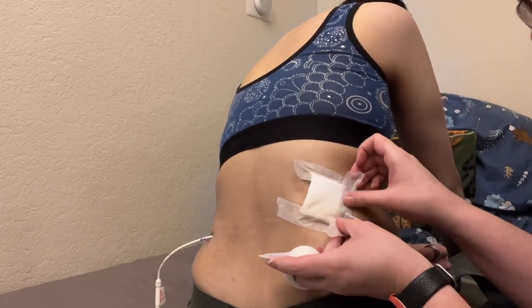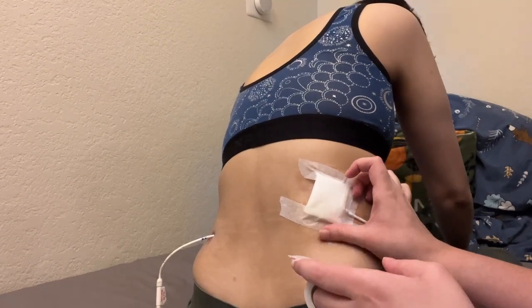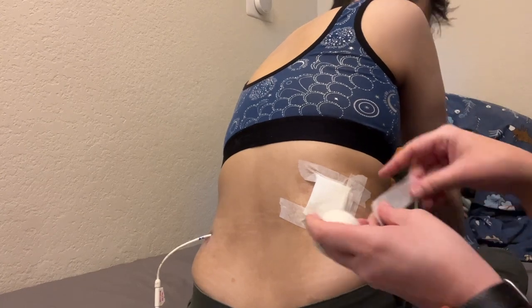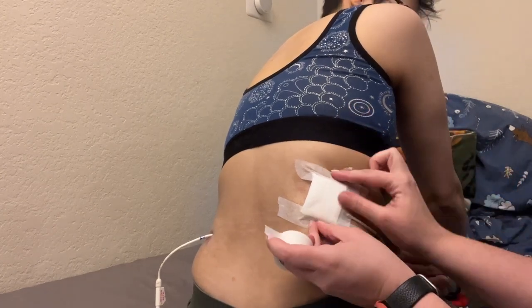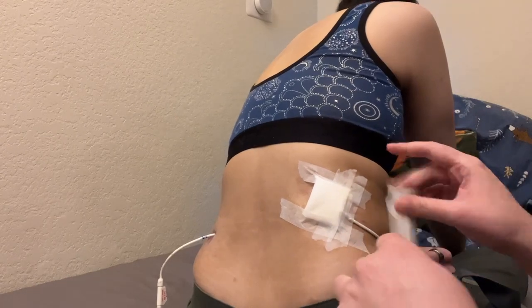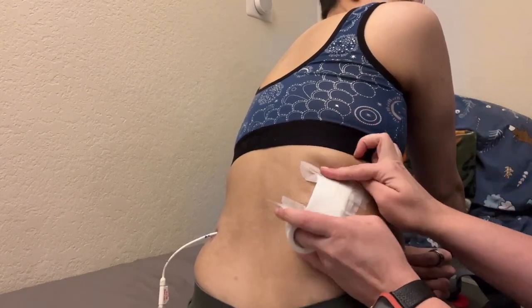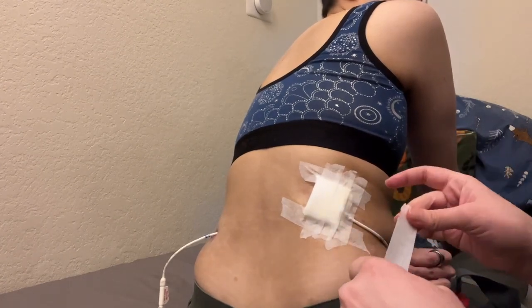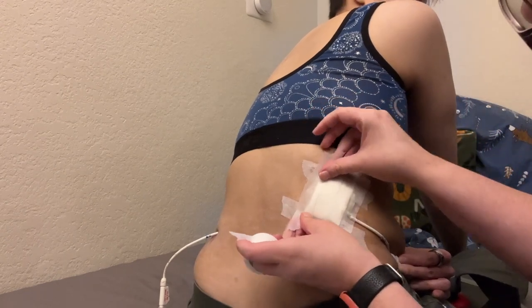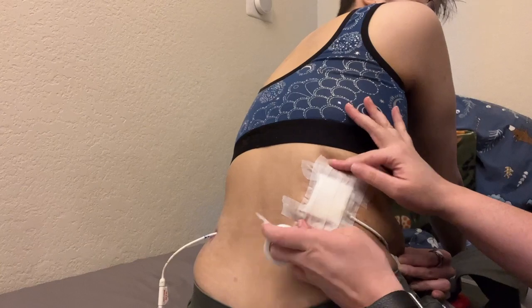Now I'm using a paper tape to completely cover the gauze, and the adhesive of the tape is sticking to where I put the Sure Prep. This paper tape — we got it at Target, it's Johnson & Johnson. These are things you can find at your local pharmacy or convenience store.